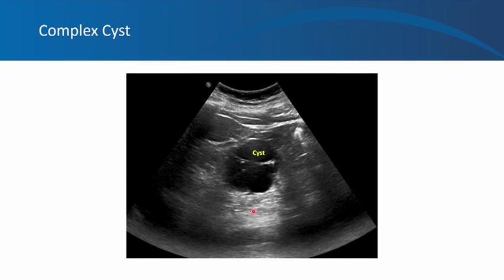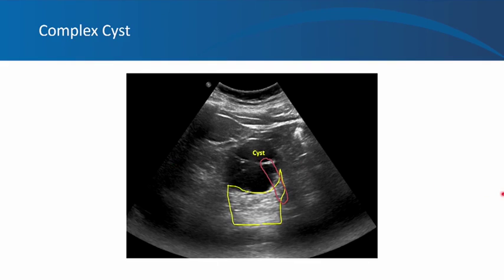The whitish area produces enhancement beneath it due to good sound wave transmission. The internal bright linear structures are fibrous septations — fibrous structures are bright on ultrasound. The brighter structures on these fibrous septae are likely calcifications, which, like stones, can produce shadowing. You can see subtle shadowing within the area of enhancement. Note that calcifications don't always produce shadowing — it depends on their size relative to the ultrasound beam width. Fibrous structures typically don't produce shadowing; they are just bright. This is therefore a complex cystic lesion.